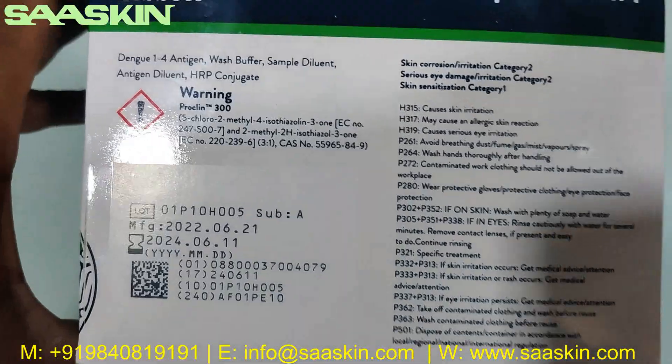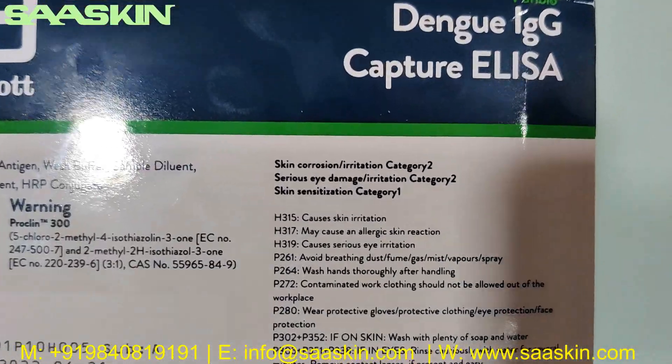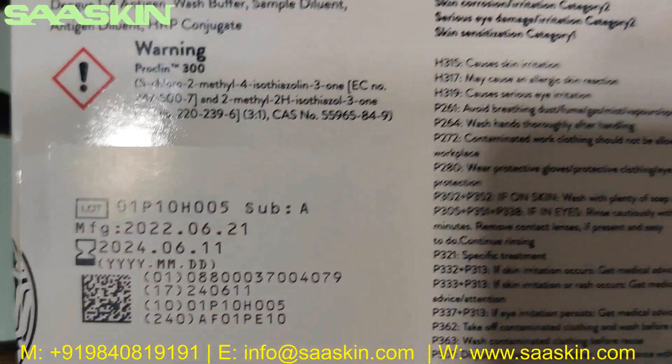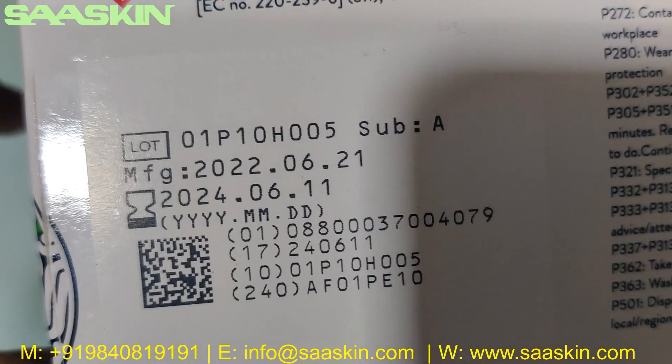I will just go around this box to show you how it looks like. You can see on a standard label you can see the expiry period.